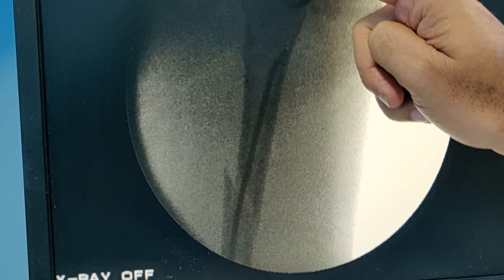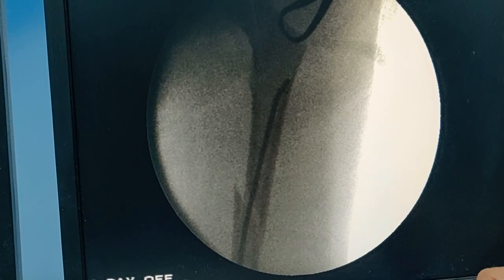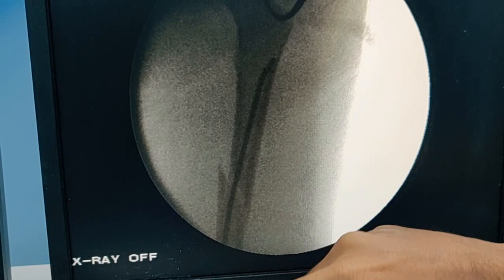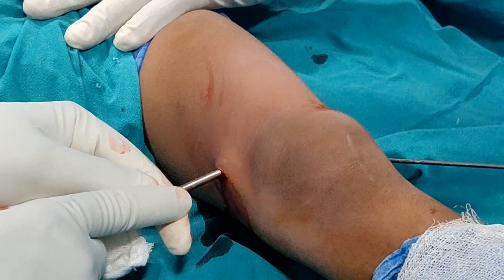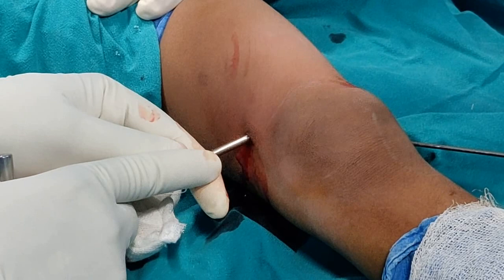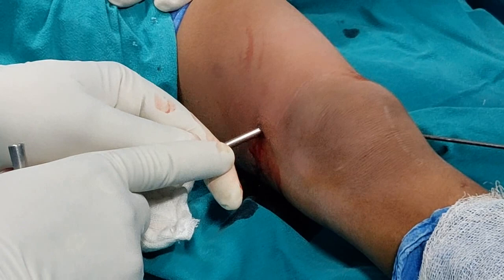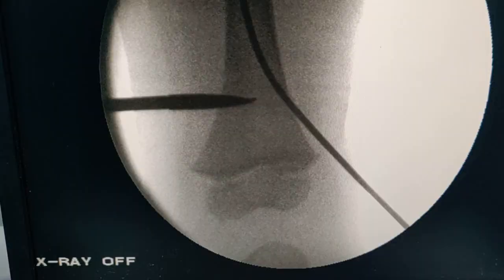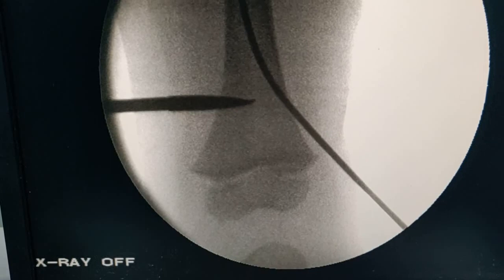You can pass both wires — medial and lateral — and bring them to the fracture site, tapping them together one by one to reduce the fracture. Or you can put one nail first; I find that one nail gives some stability and passing the second wire becomes much easier. Don't tap the nail past the level of the lesser trochanter, because you will cut the nail proud and then tap it in, leaving a few millimeters for the nail to sink. Confirm on X-ray that you are in the center of the femur — check anterior-posterior and then lateral — to ensure it is not too anterior or too posterior.